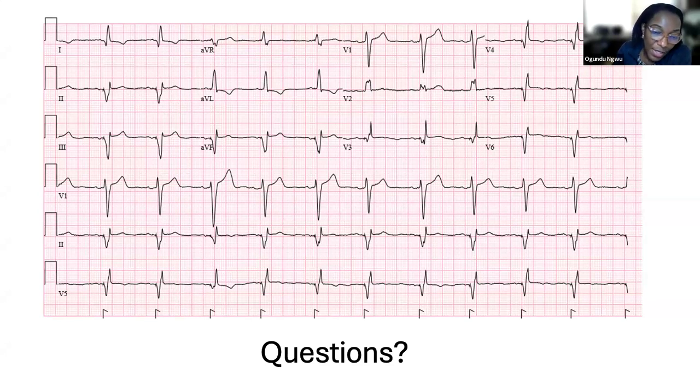But in this situation, I already told Medtronic, if I try again to get the LV lead and can't get it in, then I'm going to change it and leave his ICD lead in and then put in a pacing lead into the left bundle and hopefully synchronize him, because he has a wide left bundle and he's young with a terrible LV function.